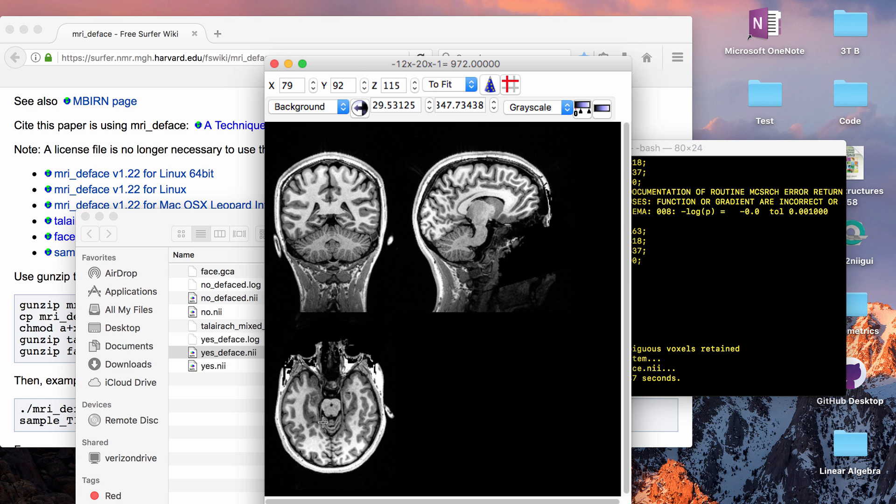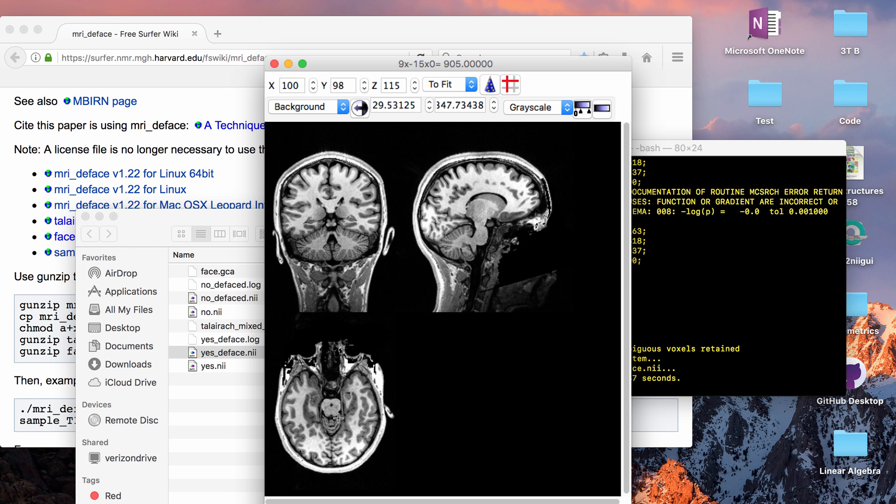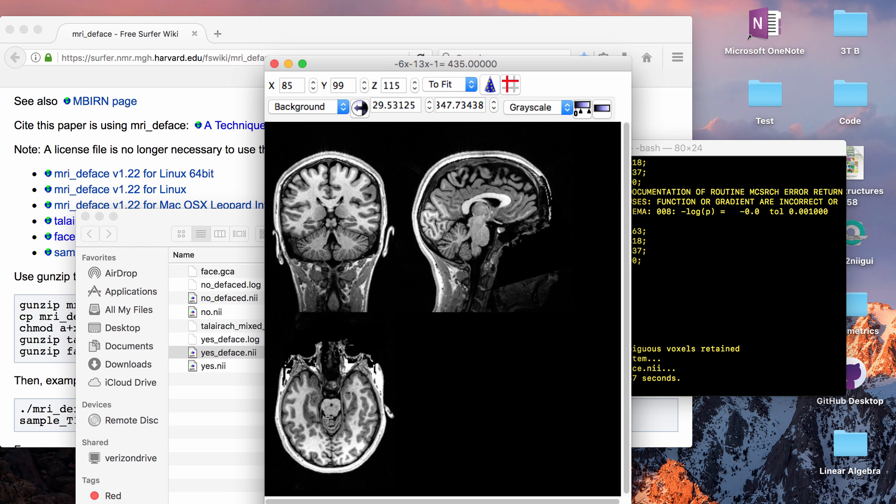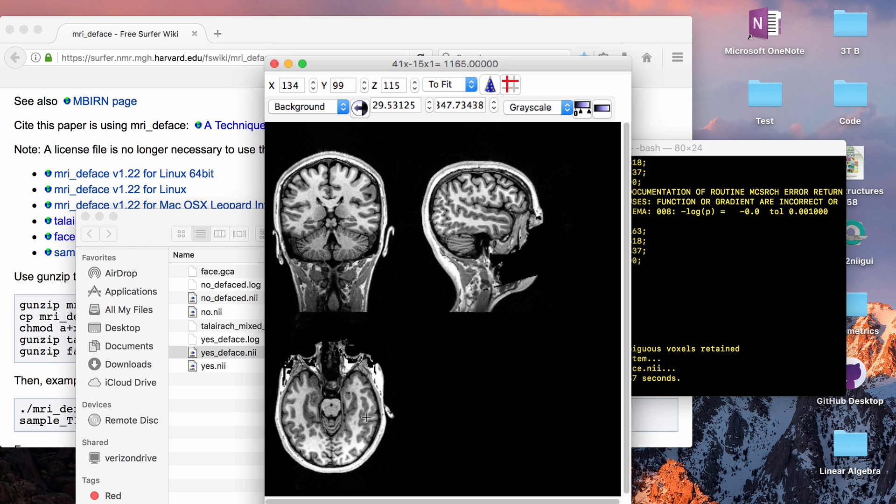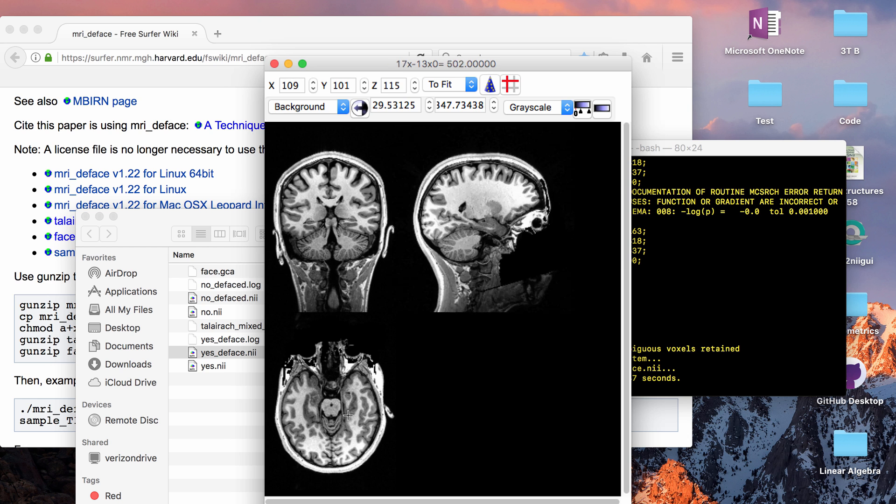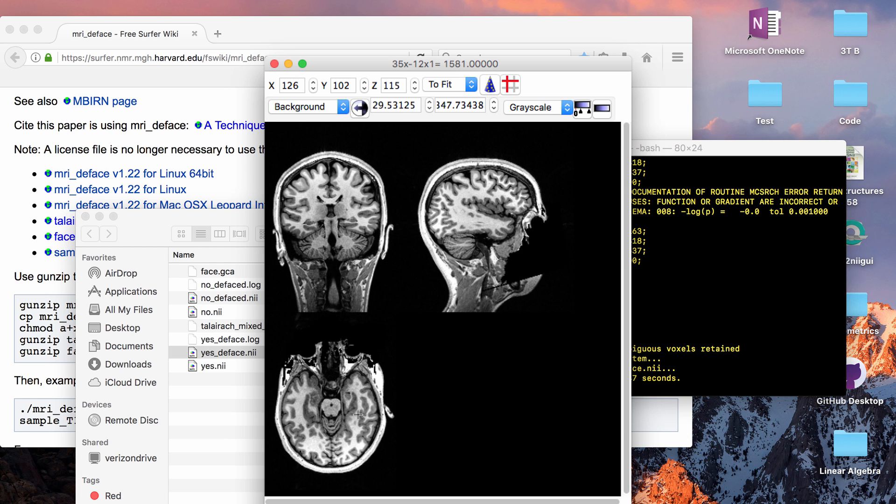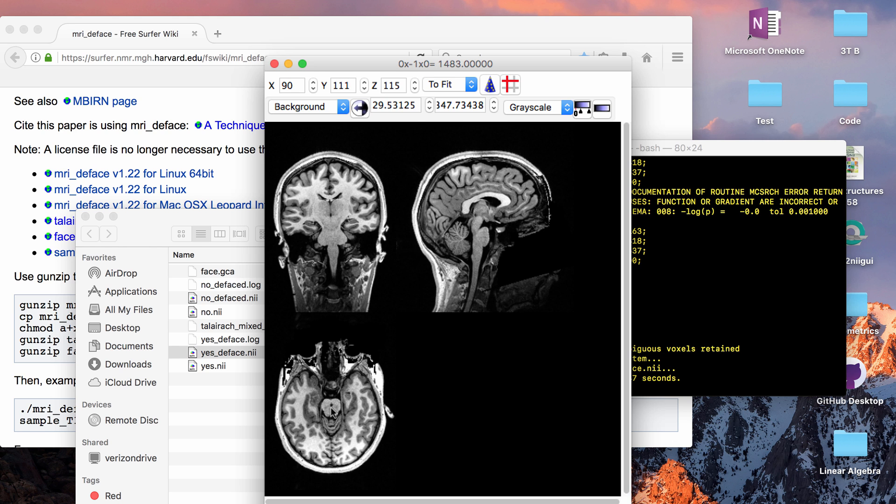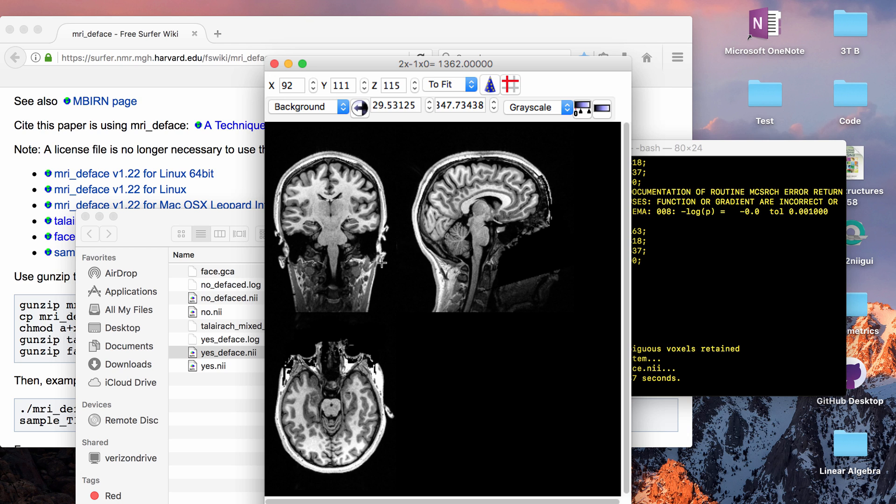So let me make just a few comments before I end the video. I think that there are a lot of defacing functions in other neuroimaging software. I haven't tested any but maybe in a future video if I find one that I think works better than the FreeSurfer version I can make a video on that. And also you might be wondering like what is the point of this if you can just send someone a skull stripped brain and you can definitely do that. You can send someone just the brain and have FreeSurfer or any other program do a brain extraction. I think the argument is that that takes a long time and that is a lot of processing in itself. So this is faster because obviously this just takes a couple of minutes if you're going to share data before you do any real processing. So I think that that's kind of the idea with defacing the data. But anyway that's it for this video and thank you guys for watching.